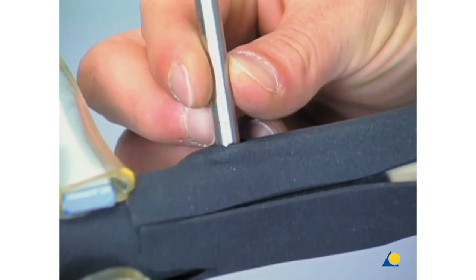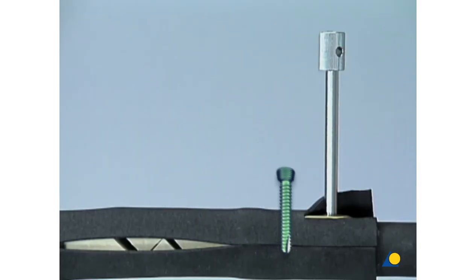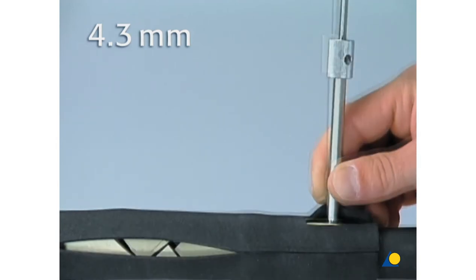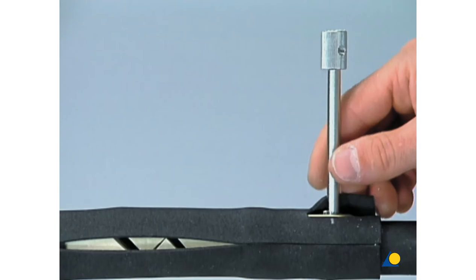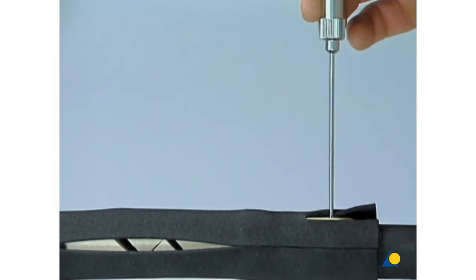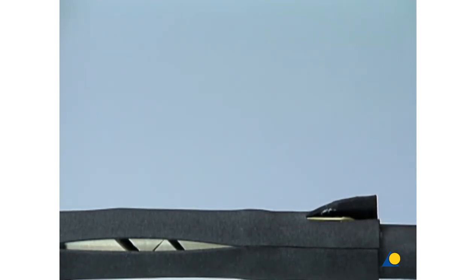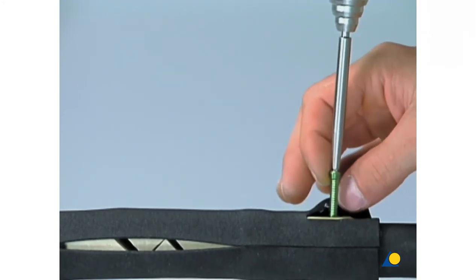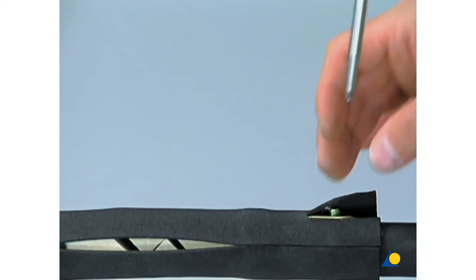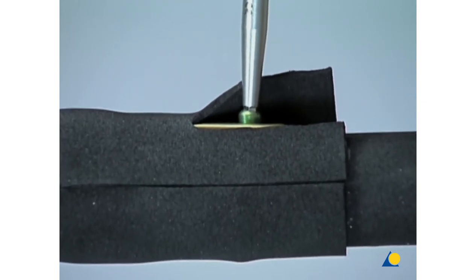The reduction of the fracture, as well as the position of the plate, should be checked once more. The plate is now fixed to the bone at one end by a locking head screw inserted bicortically. Drilling is done with the 4.3 millimeter drill bit. The drill sleeve is removed and the depth is measured. A green self-tapping locking head screw is inserted with the power drill, although the last few turns must be done by hand with the torque-limiting screwdriver in order to prevent over-tightening.